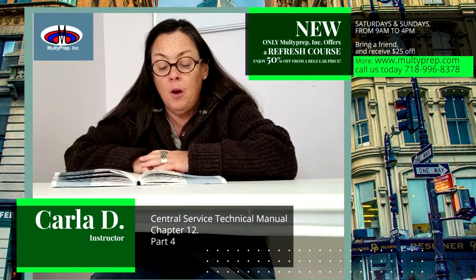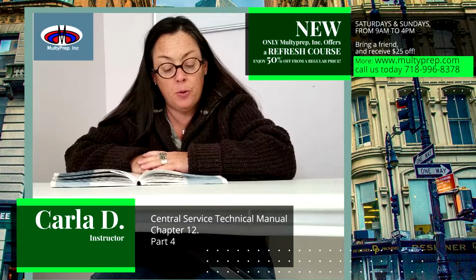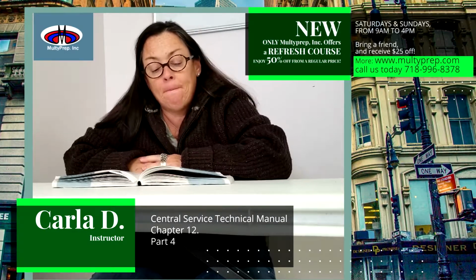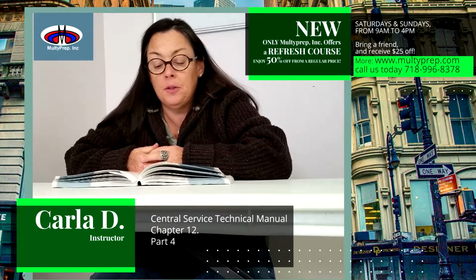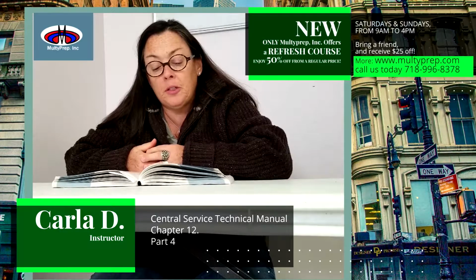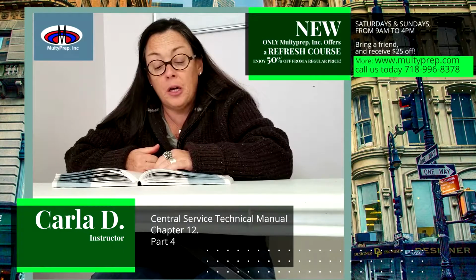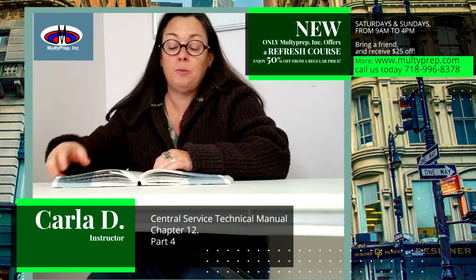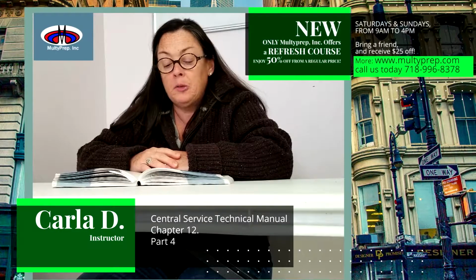Muslin. Broad term describing a wide variety of plain weave cotton or cotton polyester fabrics with approximately 140 threads per square inch. Textile packaging is still the packaging method of choice for some healthcare facilities. The selection of reusable textiles is often impacted by costs and/or environmental sustainability concerns, the desire to reduce waste generated by disposable packaging materials. Some facilities contract with off-site companies to pick up used textile wrap and then launder, inspect, and return them to the facility for reuse.